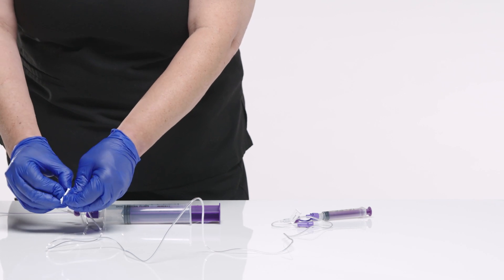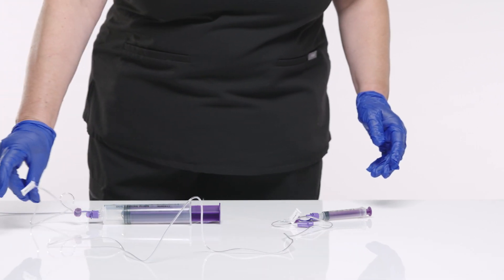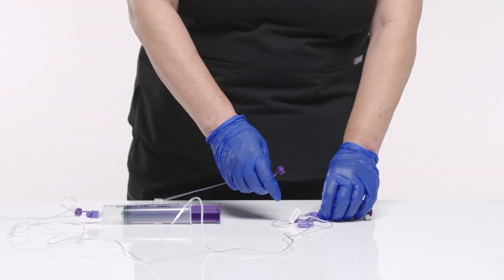Connect the EnFit male connector at the distal end of the extension set to the EnFit connection on the feeding tube.